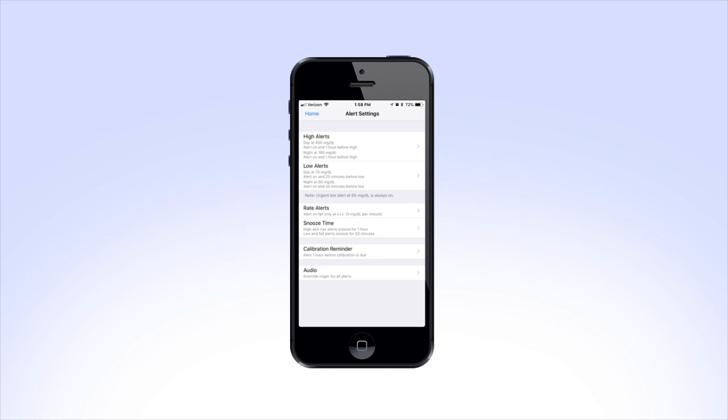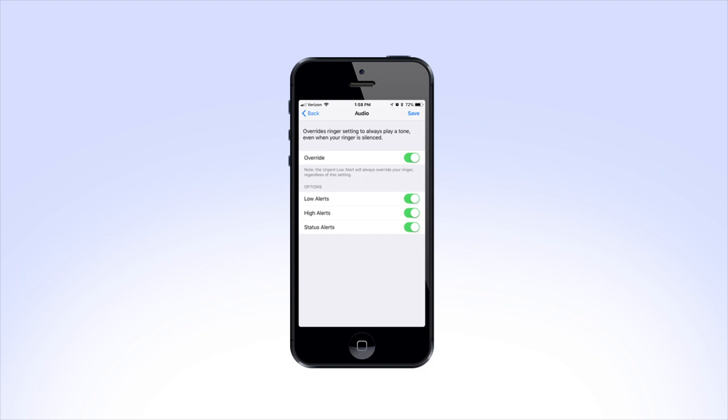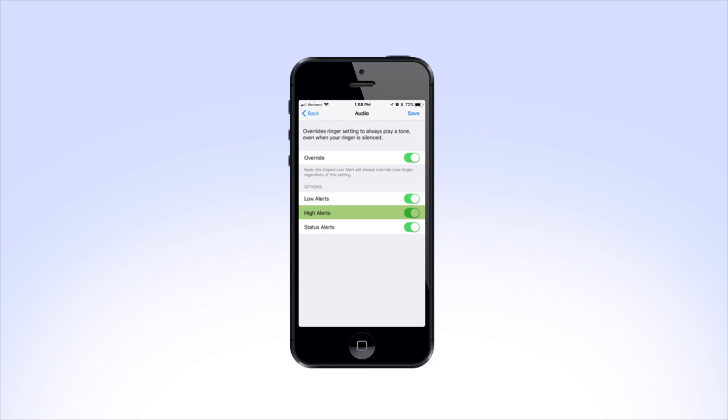To change your audio override settings, tap Audio to reach your audio settings. From here, you can turn off the audio override feature completely, or you can turn off the override settings for your low alerts, high alerts, or status alerts.